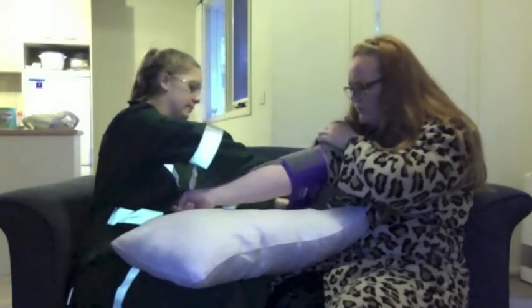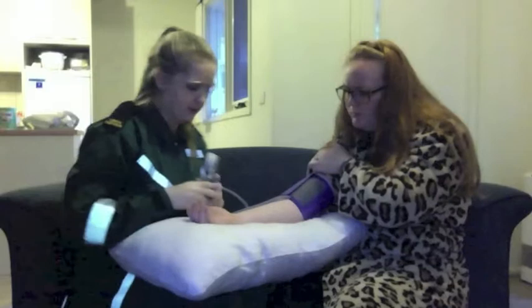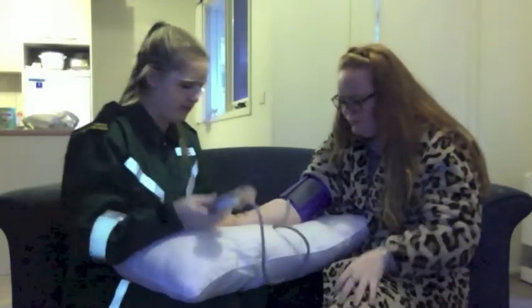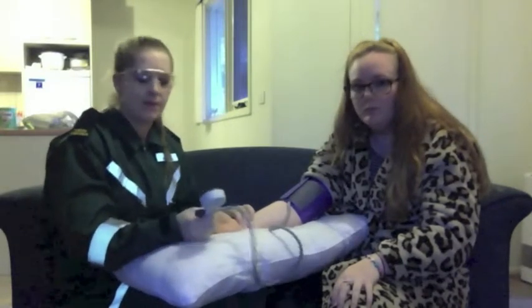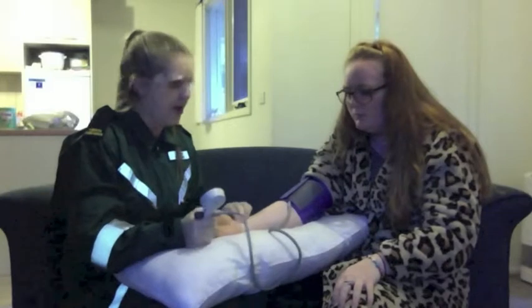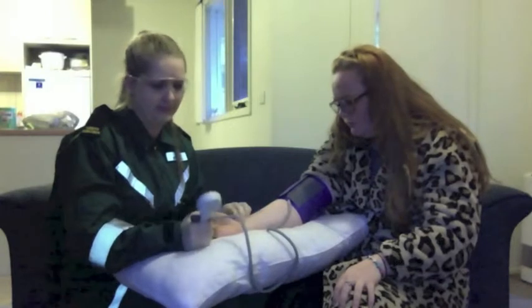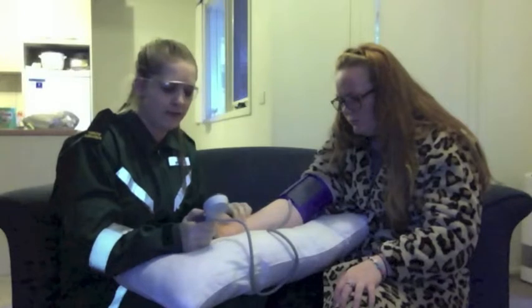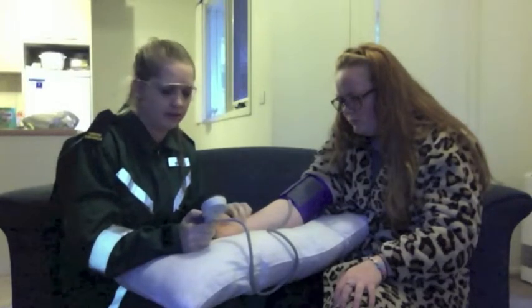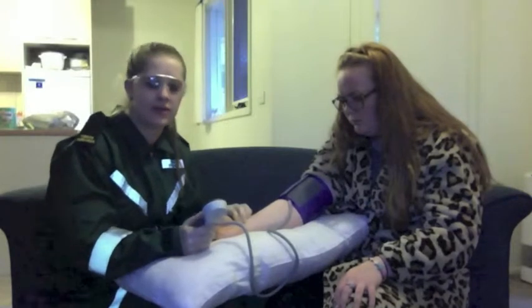That's it. Good. So again, I'm just going to find Mrs. Jones's pulse again, the same as before. Good, and then I'm going to feel for her pulse, and once I've found it, I'm going to start pumping up the cuff until I can't feel Mrs. Jones's pulse anymore. Good, and then I'm slowly going to release the cuff, feeling for when I can feel Mrs. Jones's pulse again. Good, and then when I can start feeling Mrs. Jones's pulse, that's the systolic number.